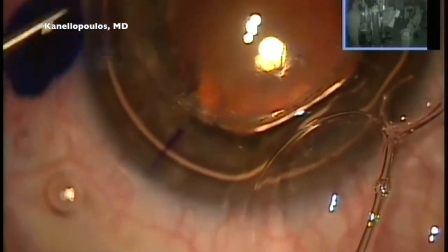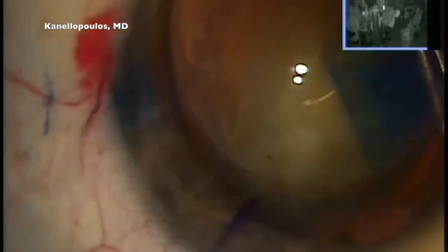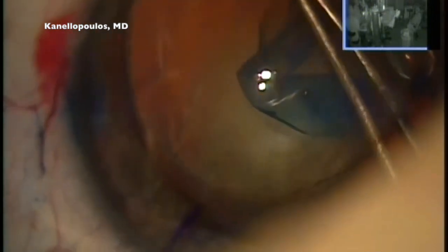I'm going to use an air bubble and stain the anterior capsule with blue dye. Then viscoat — a fantastic material — to coat the graft and reduce the possibility of corneal damage. I'm going to perform the manual continuous curvilinear anterior capsule rhexis. Obviously this is not an ideal case for femtosecond surgery, as we can all assume. The key thing, although the landmark arcs are distorted, is to stay central with a nice curved capsular axis. The blue dye has the added benefit of making the anterior capsule a little bit tougher and easier to tear. I'm showing the capsulorrhexis in its entirety, because I think it's probably one of the most challenging aspects here — it should not be rushed, and it will make the rest of the procedure relatively simple.